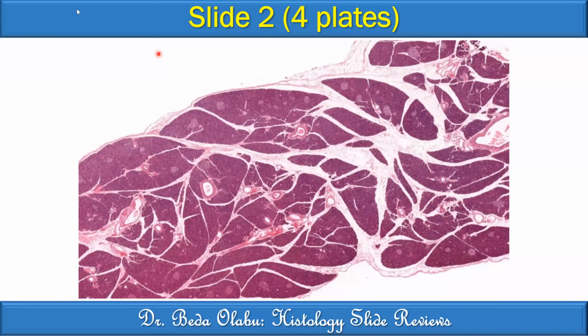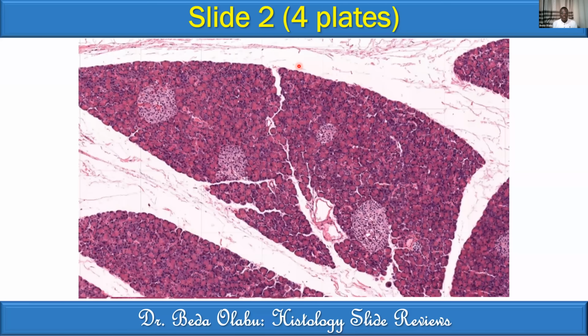The first slide, I can see presence of lobes and also presence of ducts. Well, that's what I can say in the first slide. Okay, so lobulations and ducts. Good. Second slide, second magnification. I think I can see serous acini. Okay, so second magnification, serous acini. I go to third magnification.